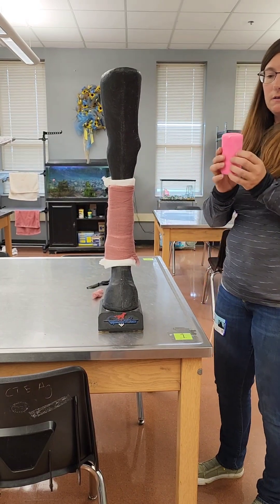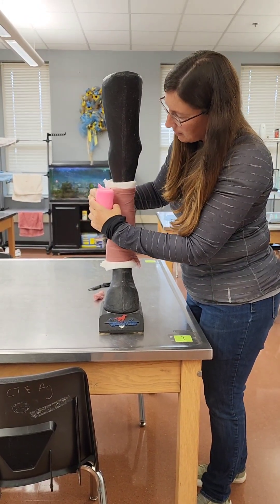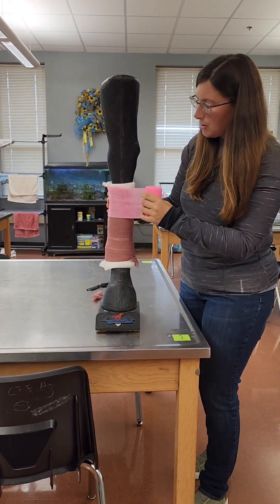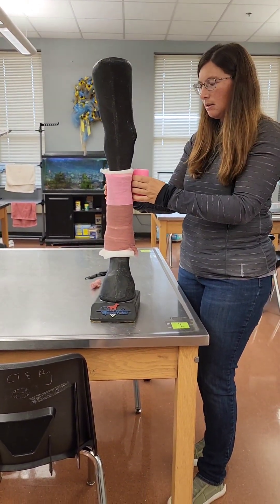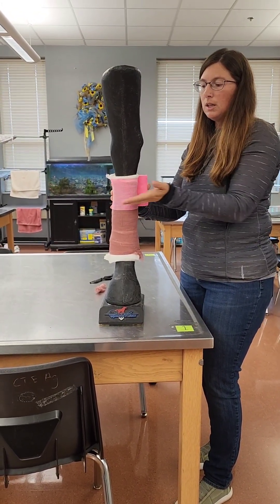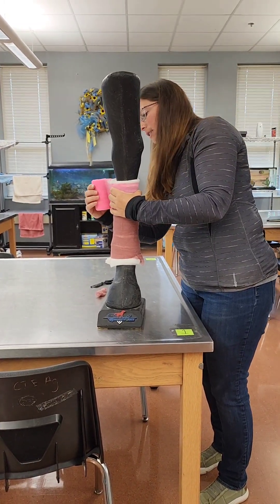Then you take your vet wrap. Starting at the top and wrapping around the front of the leg, you want to come above the brown gauze but below the top of the cotton. You want to stretch it about 50%, and you only pull across the front of the leg across the bone — you do not pull against the tendons.